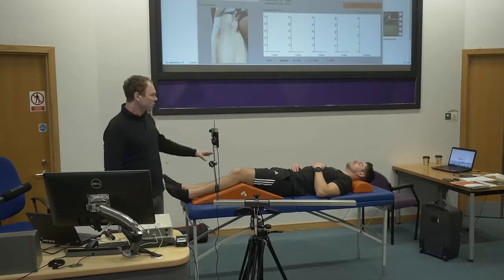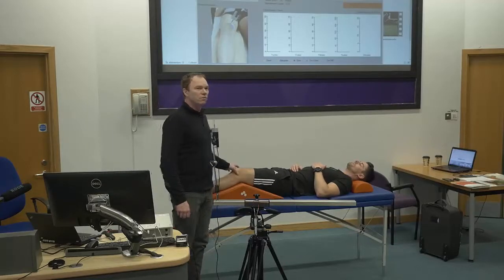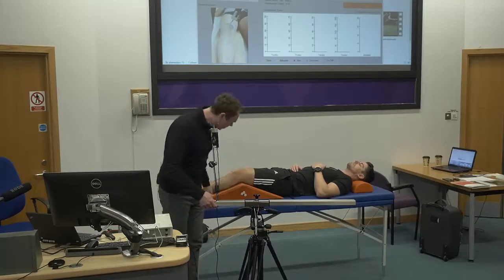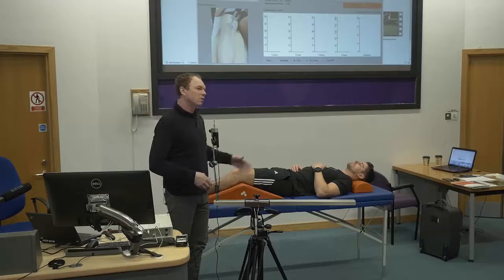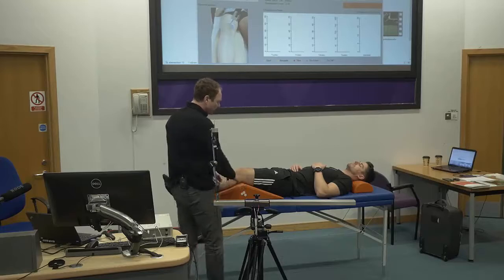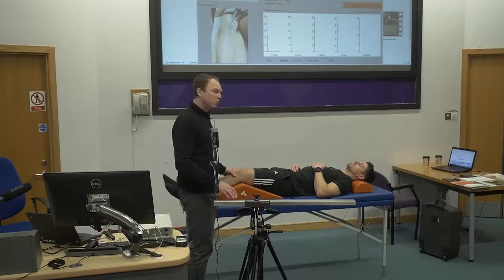First, the position of the subject. These support pads are used to ensure 30 degrees of flexion in the knee. This support pad is not symmetric, so the short side usually goes towards the hip and the long one goes towards the ankle. What you want to achieve is to get the whole leg to be supported by the support pad.